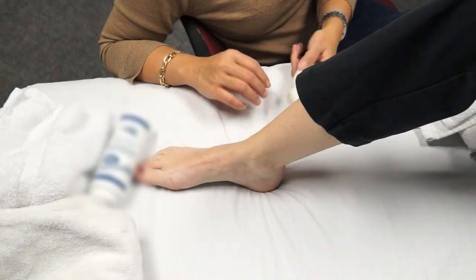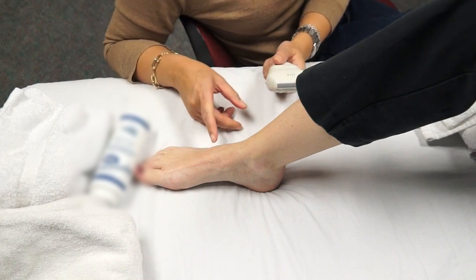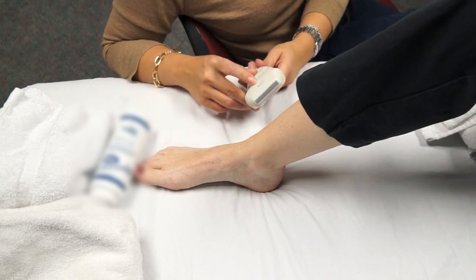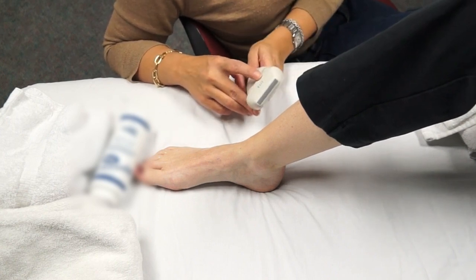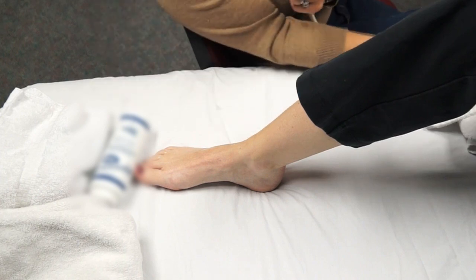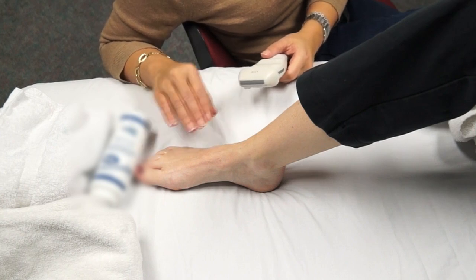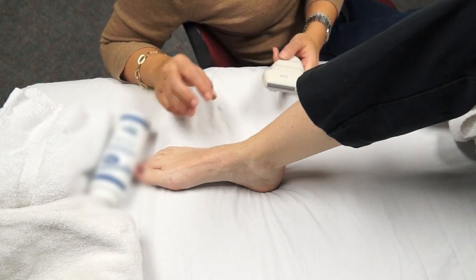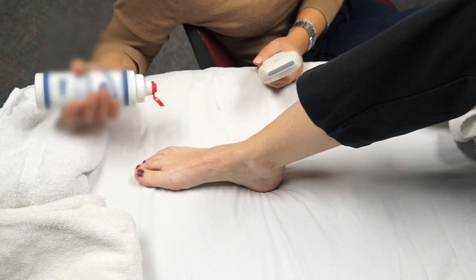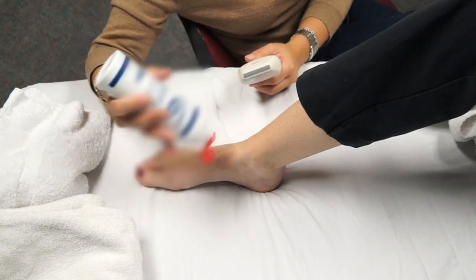And now we'll be imaging the ankle. And again, like all other musculoskeletal studies, for superficial structures, you would like to use a linear transducer. This is a 17 megahertz transducer, so I've moved up in megahertz because we're looking at very superficial structures, and this is for superior resolution. For the anterior ankle, we'd like to have the patient supine with their foot flat on the table or on the stretcher. And then, just like with the knee and with the elbow, we will be imaging in 4 compartments, and we'll be starting with the anterior ankle now.